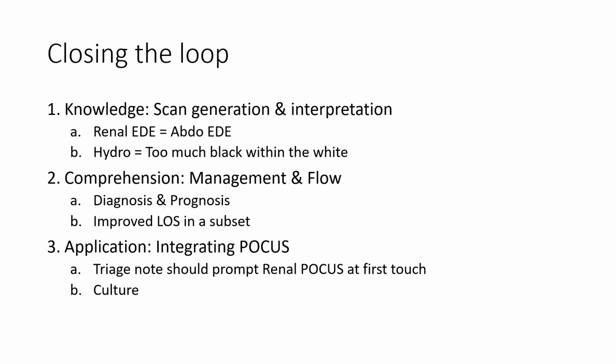Culture is important. If you work in a big shop where all renal colic patients see urology and follow-up, and the ticket to the urology clinic is a CT scan, that's going to create some challenges. And of course, you need to learn how to do the scan. There's plenty of options for learning, including online courses and boot camps, and there's plenty of free stuff on YouTube.